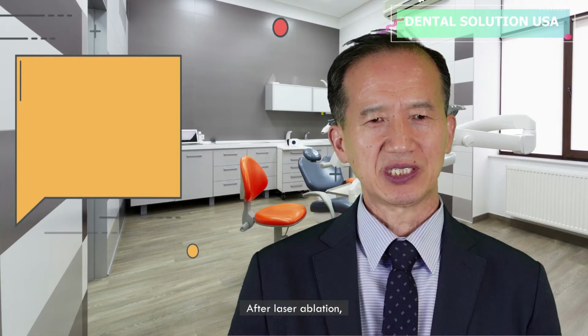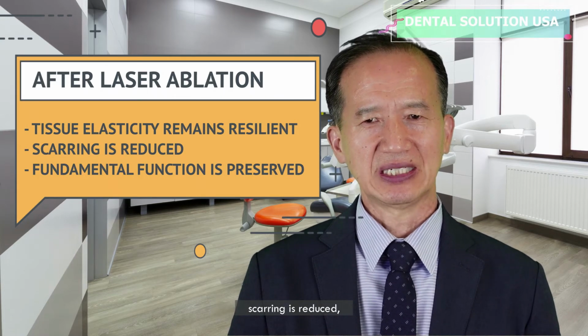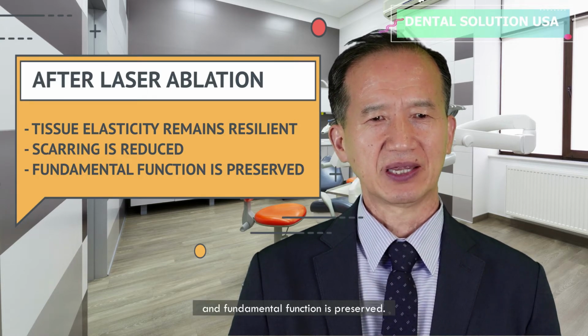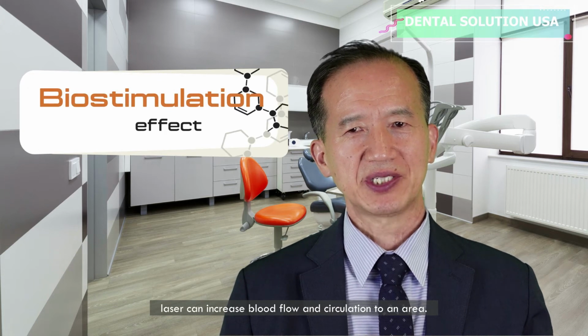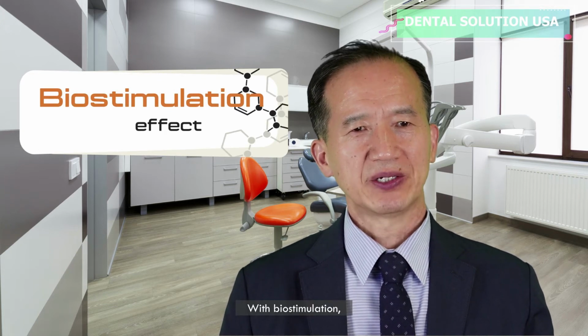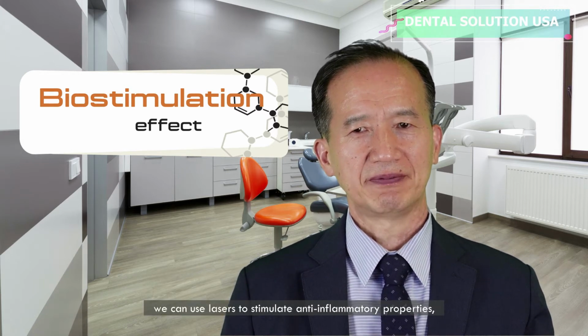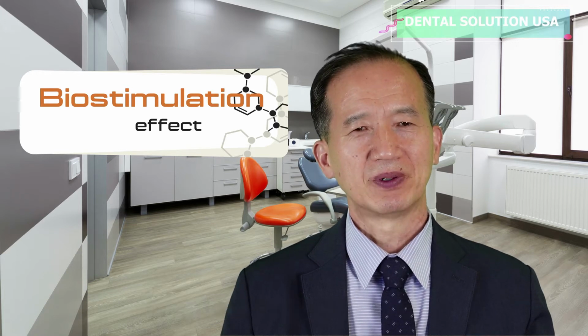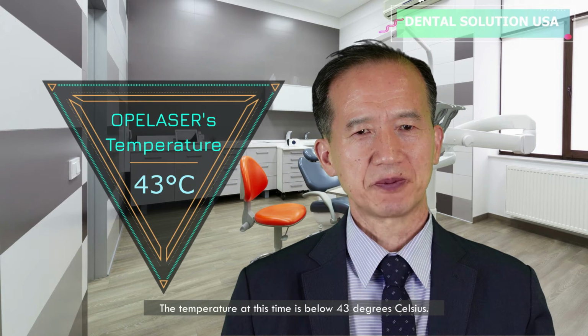After laser ablation, tissue elasticity remains resilient, scarring is reduced, and fundamental function is preserved. As you know, laser can increase blood flow and circulation to an area. With biostimulation, we can use lasers to stimulate anti-inflammatory properties, promoting wound healing and decreasing inflammation. The temperature at this time is below 43 degrees Celsius.